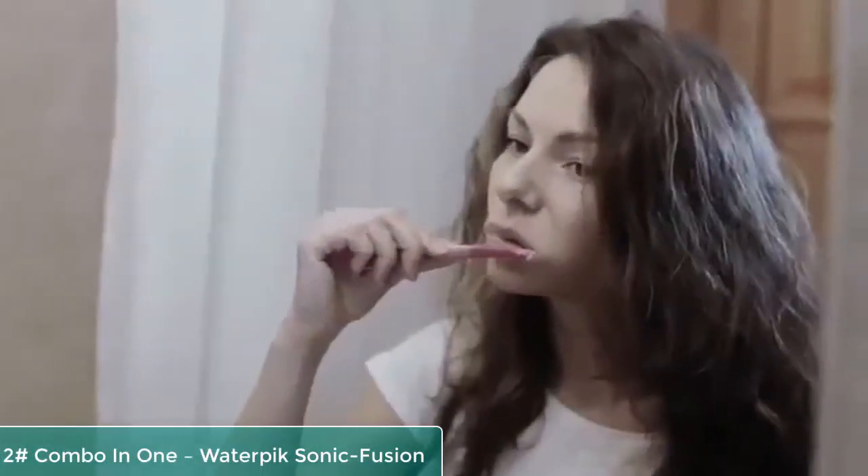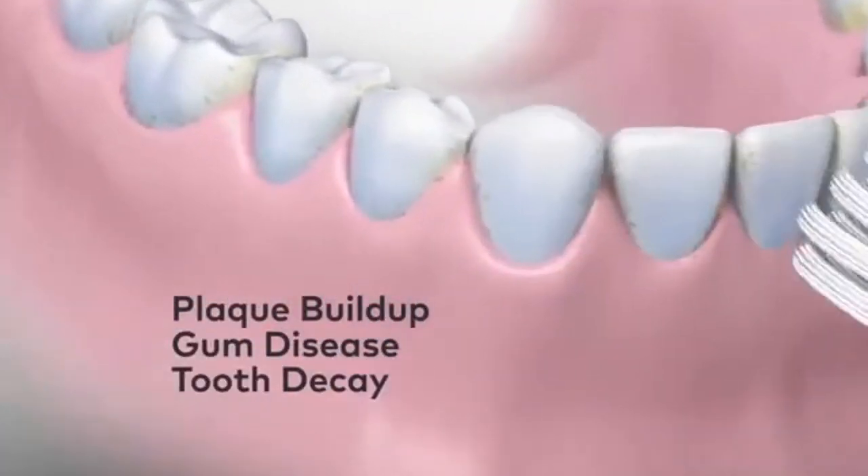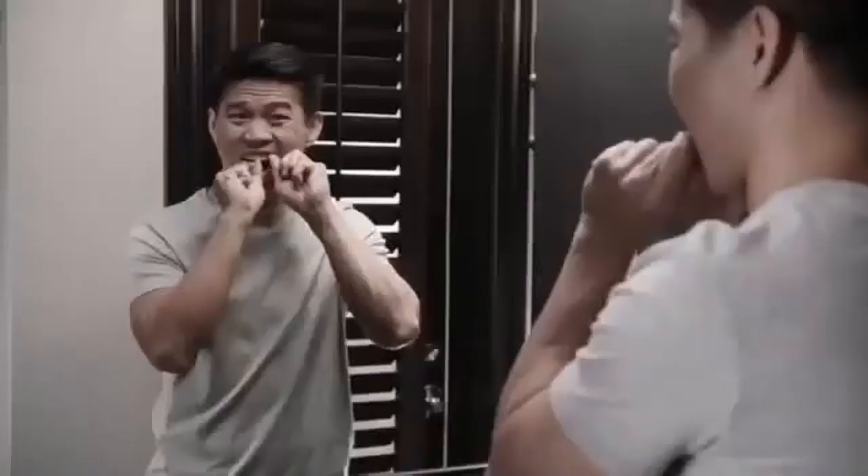There's a dirty little secret in oral care: just brushing alone is not enough. If you just brush and don't floss, you could have plaque buildup, gum disease, tooth decay, and bad breath. But string flossing is a hassle and can be uncomfortable.